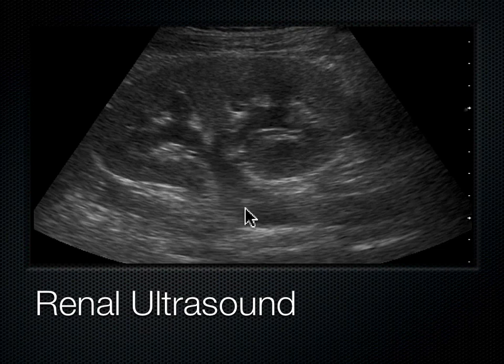And the ureter comes down, one from each kidney, they come down and they enter into the bladder, in the back of the bladder. And you don't see the ureters very well on ultrasound because the ureters are covered by bowel and fat and things like that. So they're really hard to see. They're very small usually. Unless they're dilated, then you can see them. So once the ureter kind of exits the kidney, we no longer see it.